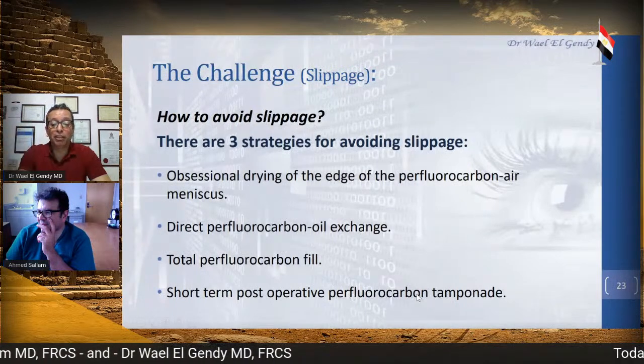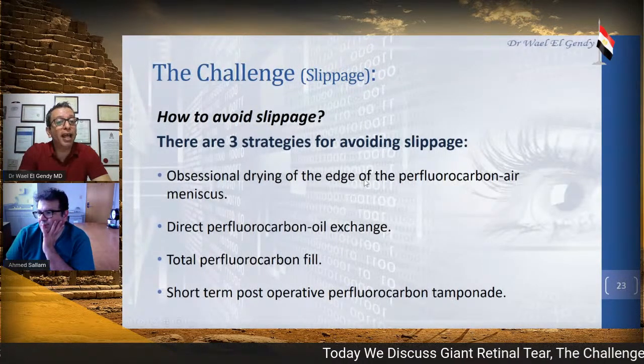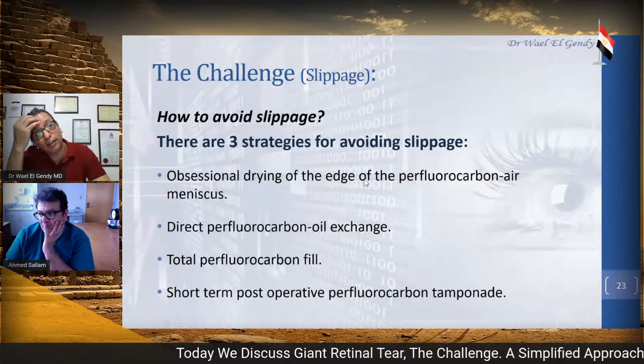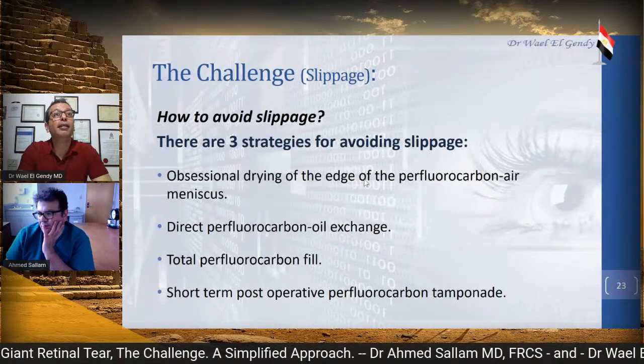I'm going to show some pictures of the first option, the obsessional drying, and then I'm going to have you, Dr. Ahmed, tell us about the short-term post-operative perfluorocarbon tamponade.